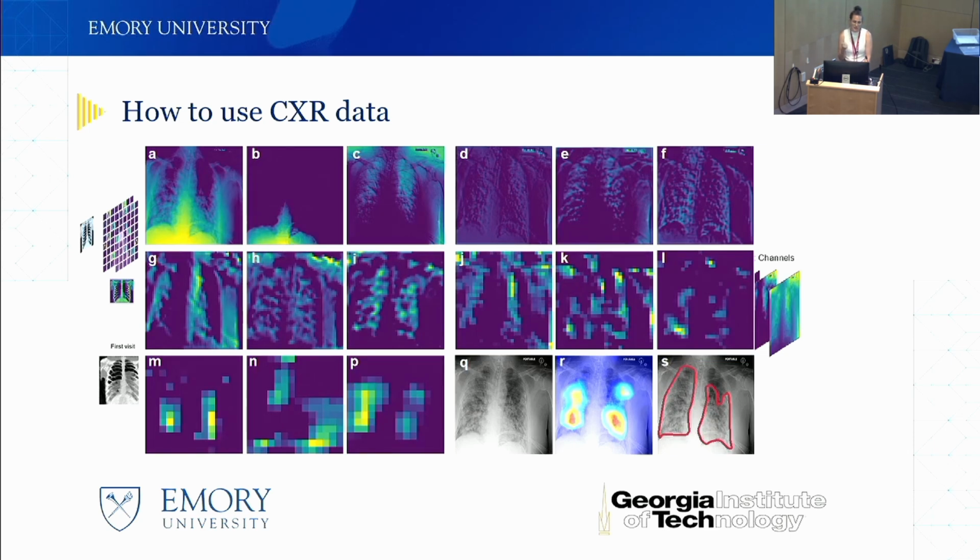Should we add a segmentation model? Could we turn off filters that look at bypasses, that look at pacemakers? Sometimes these filters can reveal a lot about what your algorithm actually looks at. This becomes harder the deeper you go into your convolutional network, because here I can still see that these are lungs and this is a spine.